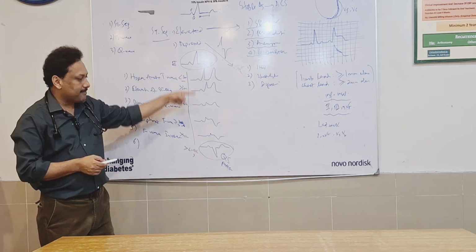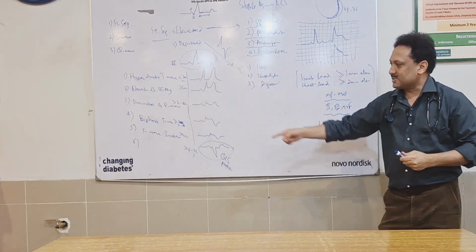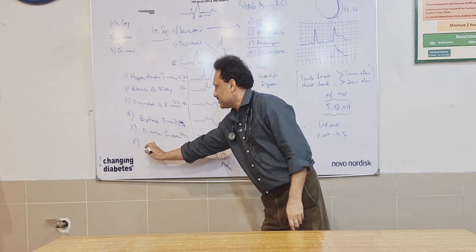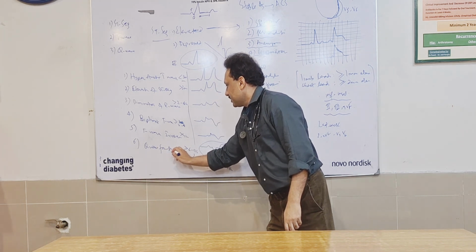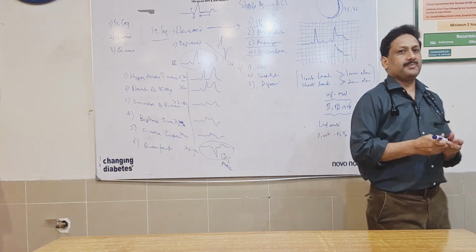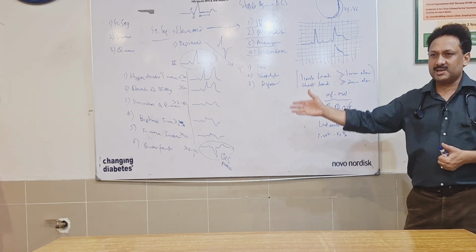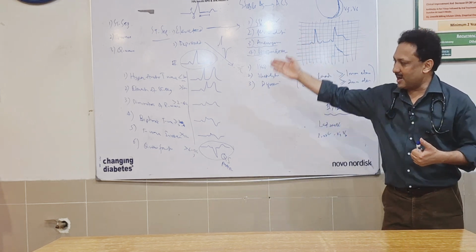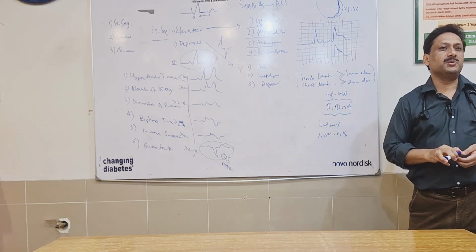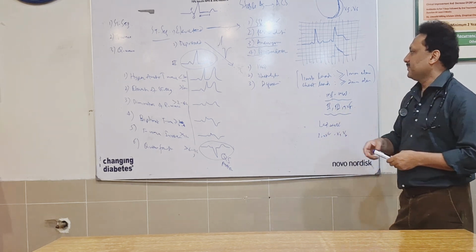So please remember these 6 different steps. Here the last one is Q wave formation. So remember these 6 stages. A person necessarily may not go through all these 6, but in many cases, that is the sequence you see in the setting of myocardial infarction. Remember this thing. This is another very important thing.